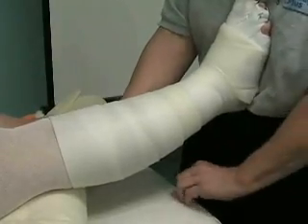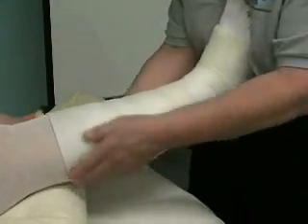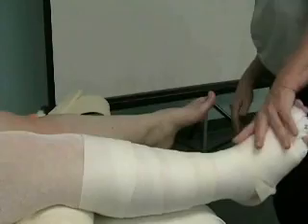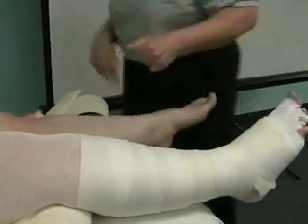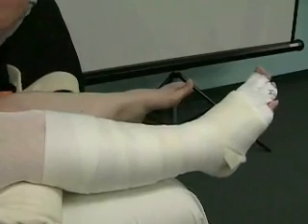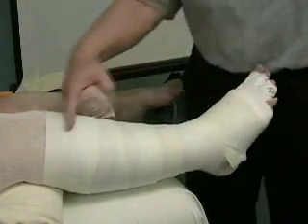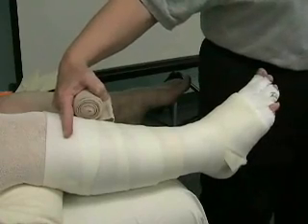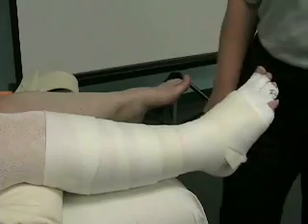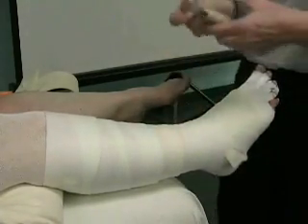Usually I have a chair in my room and I'm able to have all my tape available so I don't have to worry about where my foam and my tape is. Now I'm going to use an 8 centimeter. I'm bandaging half a leg while the patient is laying down and then I stand them up — this way it's a lot easier, and then I have her stand.